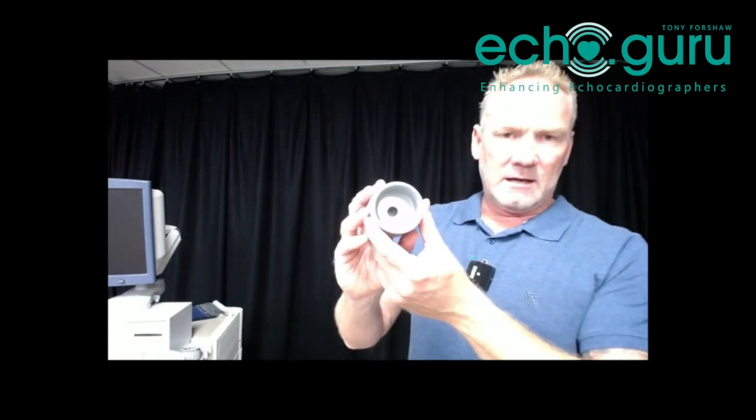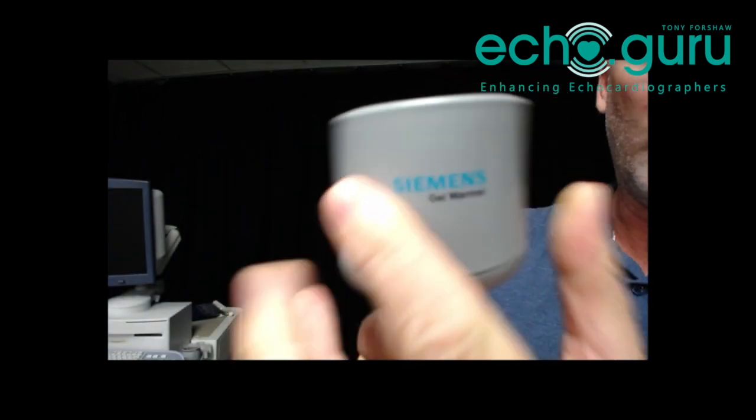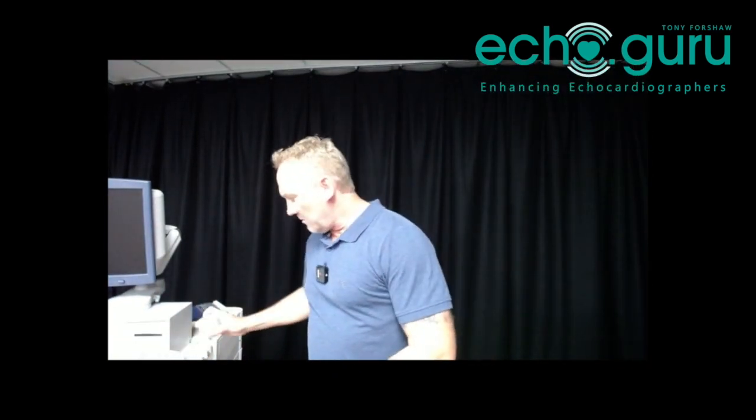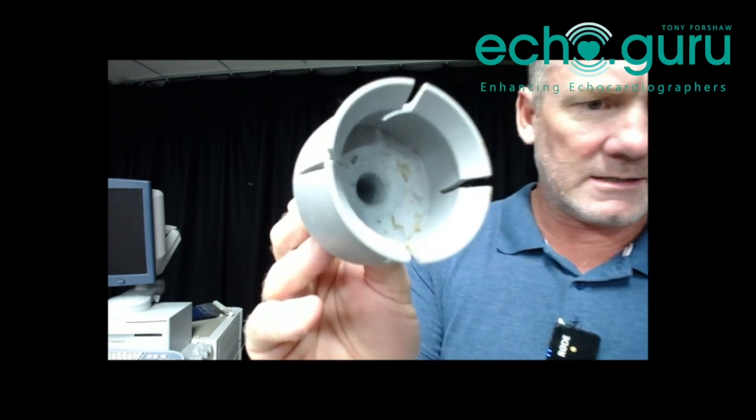My absolute pet hate is gel holders. These can become disgusting beds of bacteria very quickly if people aren't maintaining their equipment. Here we can see this is kind of gross — there's a build-up at the bottom of some dried gel which hasn't been cleaned properly. This is a warming type which plugs into an adapter and warms the gel. I'm going to use some antiseptic wipes to get it all cleaned up without damaging any of the electrics by soaking it in water. The older non-warming ones you can drop straight in water — this one is just a silicone container. It's particularly disgusting and we're going to get it all tidied up.